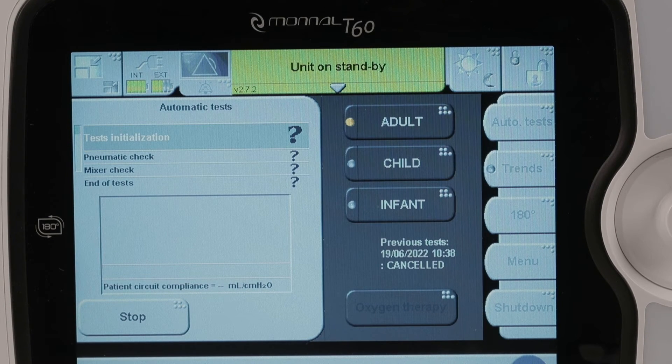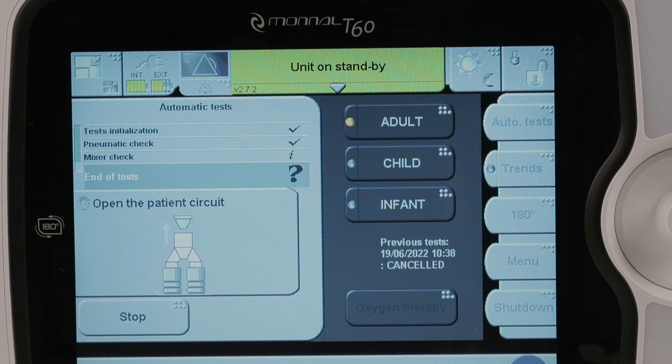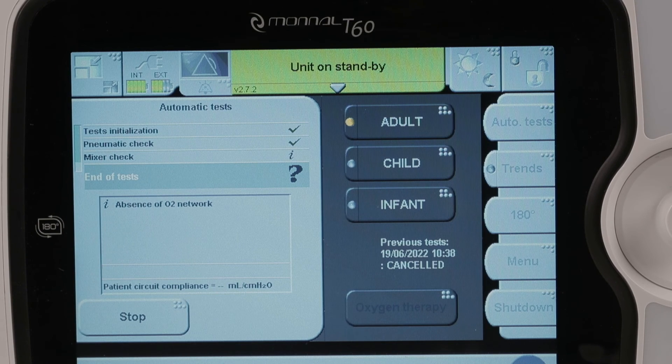The first step is to check the circuit for leaks. The second step, the longest, carries out the pneumatic checks. The third step is to control the mixer. At the end, the machine beeps to prompt you to remove the cap at the proximal part of the circuit to measure the resistance and compliance of the configuration. This window displays the information and potential errors that occurred during the autotests.